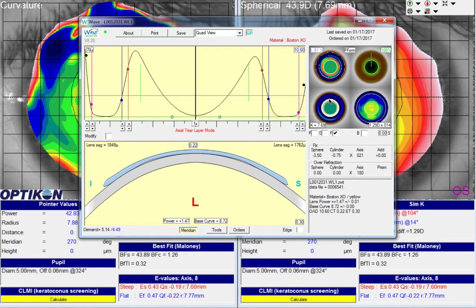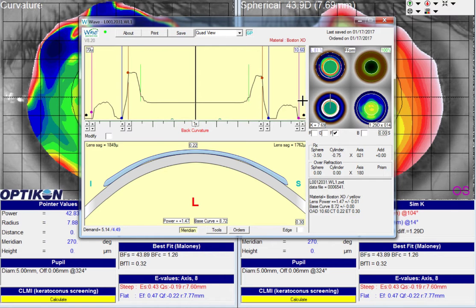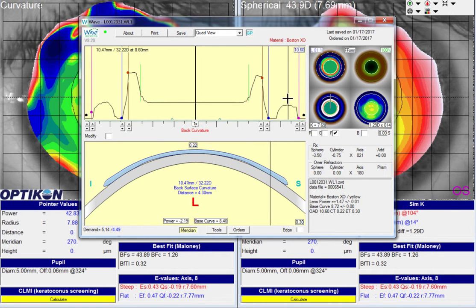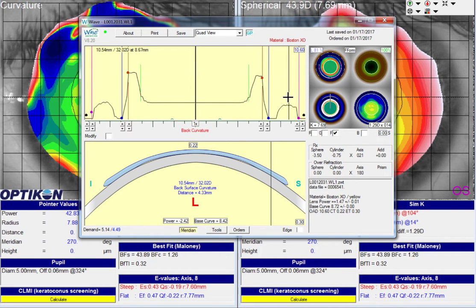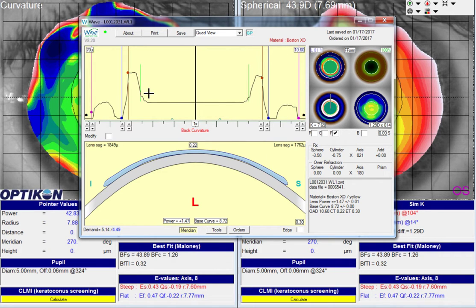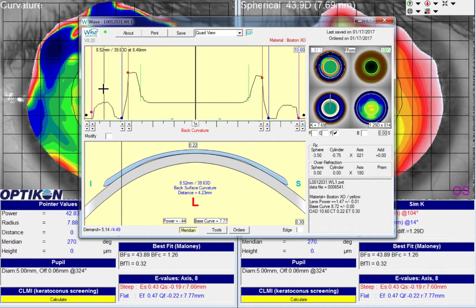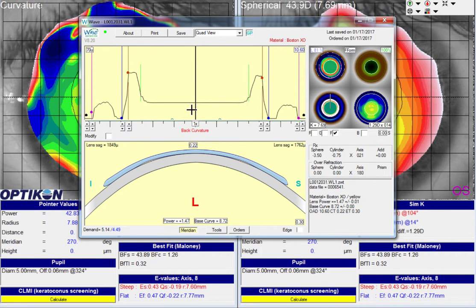If we come back to the patient's lens and look at the curvatures on the back of the lens, we can see that superiorly, down towards the edge of the lens, we're in the low 30s, whereas inferiorly we're up in the mid to upper 30s. So we've got quite a bit of discrepancy between the curves within the landing zone between the superior and inferior corneas, and I think that's affecting how the lens is fitting.